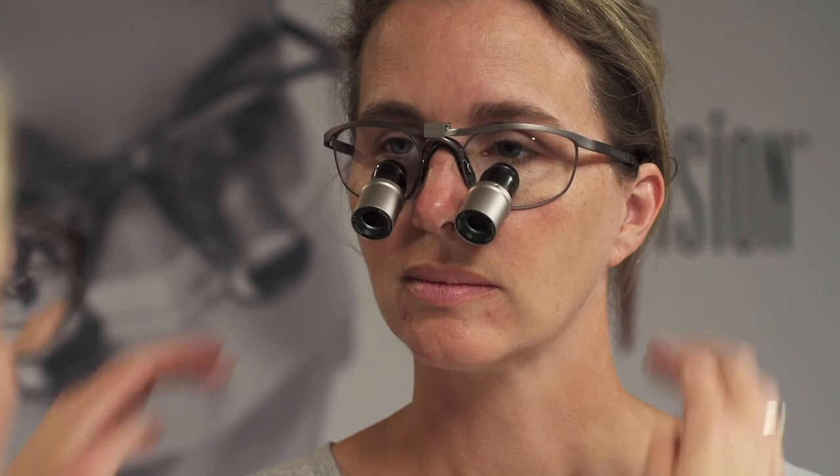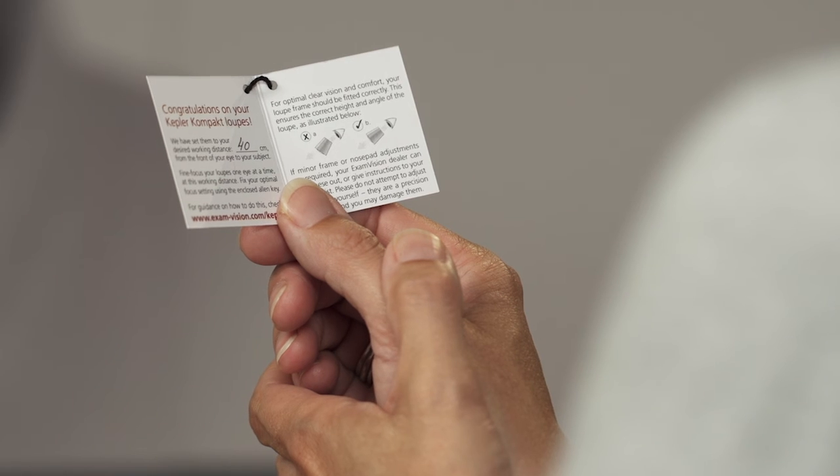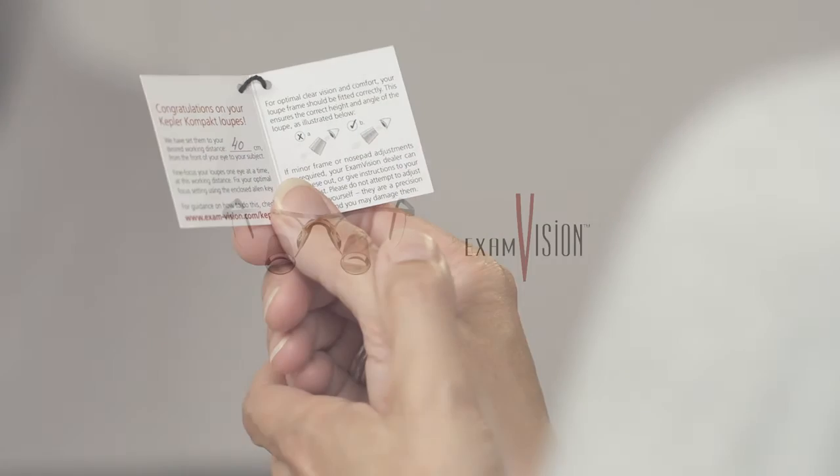Your loops should now be perfectly focused and ready for use. Your optical experience should be excellent. If you experience any problems with alignment or shadowing, check our video entitled 'Does your loop fit correctly?' or call your ExamVision dealer for assistance.